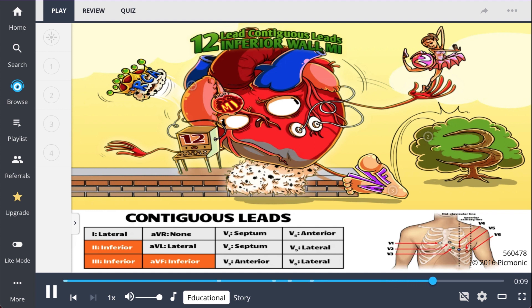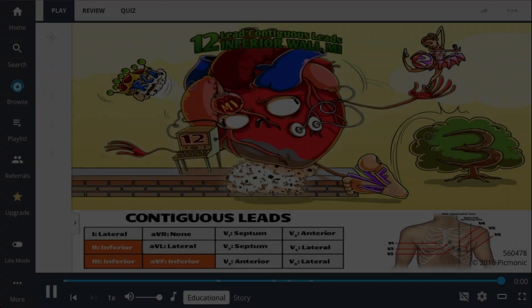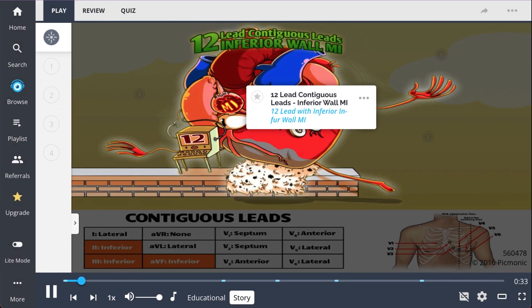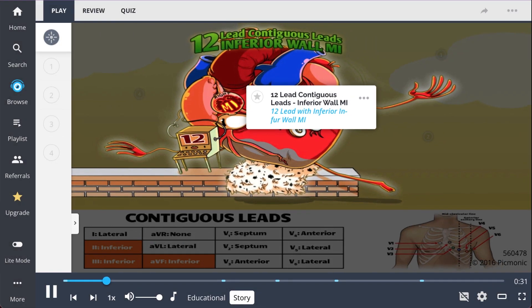There are Q wave and ST segment changes in leads 2, 3, and AVF. This all occurs because of ischemia to the right coronary artery. The 12-lead ECG machine is attempting to save the royal heart yet again.